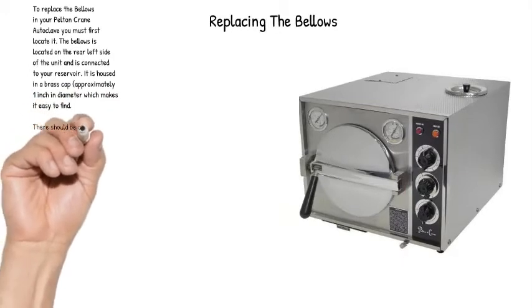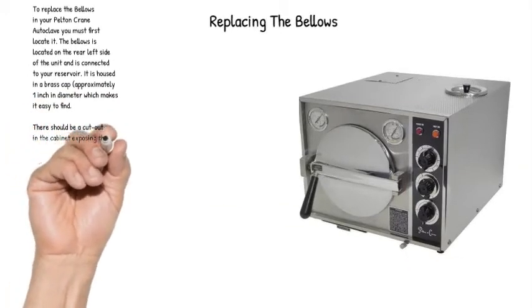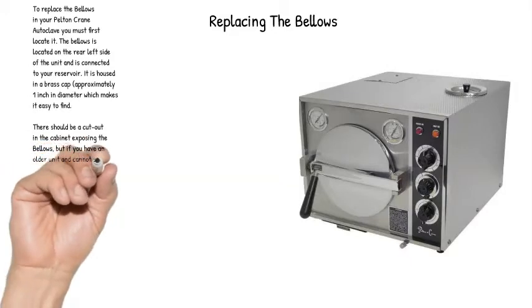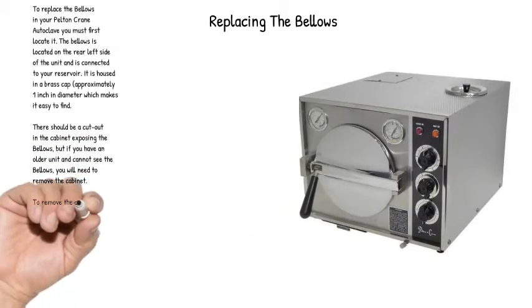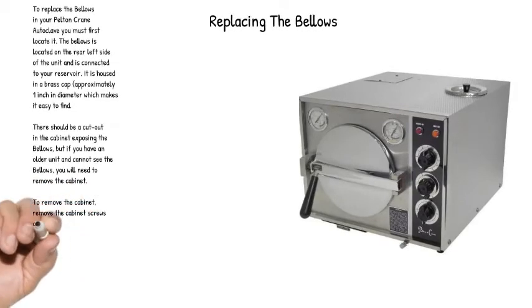It is housed in a brass cap, approximately one inch in diameter which makes it easy to find. There should be a cutout in the cabinet exposing the bellows, but if you have an older unit and cannot see the bellows, you will need to remove the cabinet.